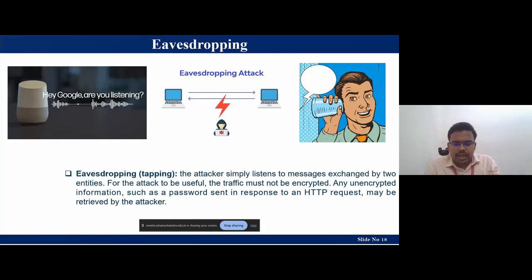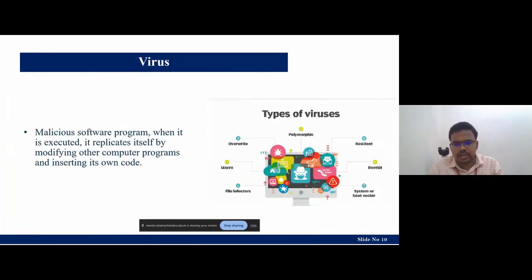But in a medical scenario, it's very, very dangerous. When the attacker uses the passive attacking mechanism, that will be very dangerous because they keep on listening to the health parameters of the patient. So at any point of time they can take access to the device and they can create that.